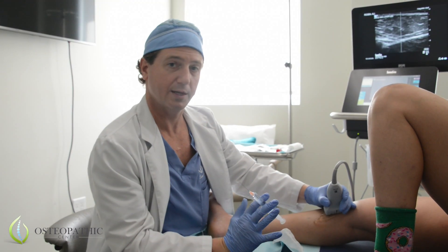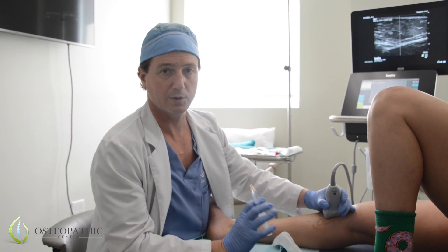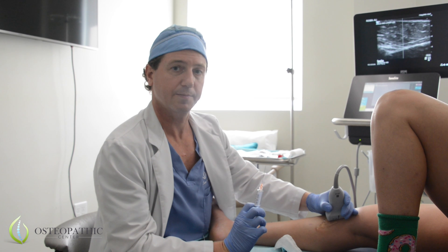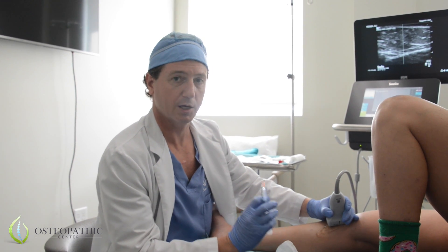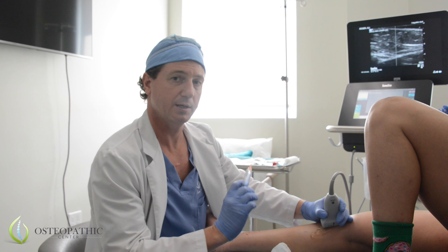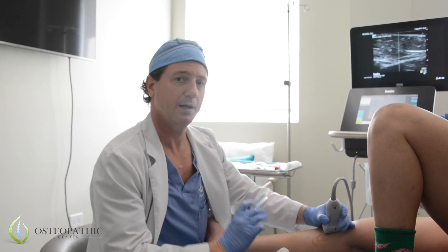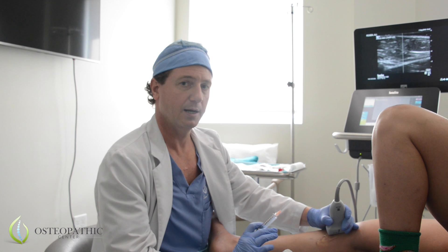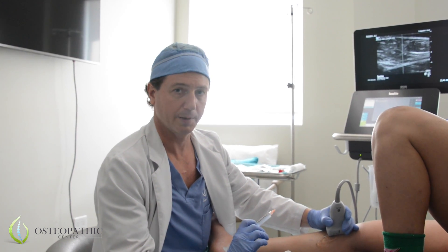I've identified on ultrasound an area between the soleus and the gastroc where the fascia is torn off. I'm going to go in with lidocaine under ultrasound guidance to put the medicine directly there. Afterward, we're going to retest her activity to see if that pain goes immediately away.